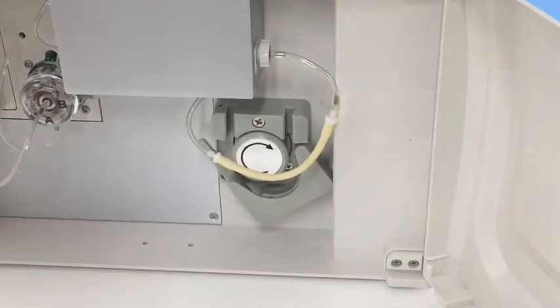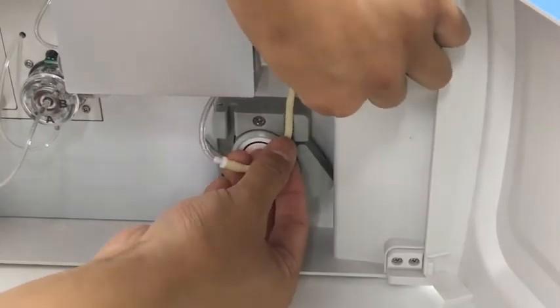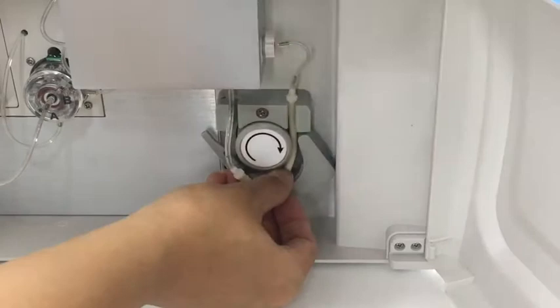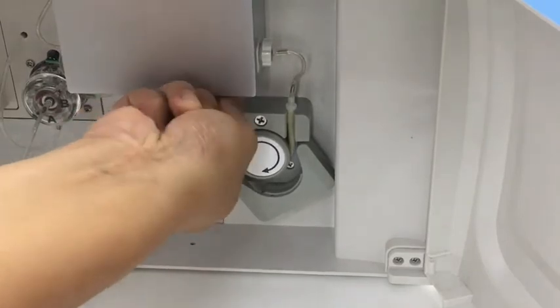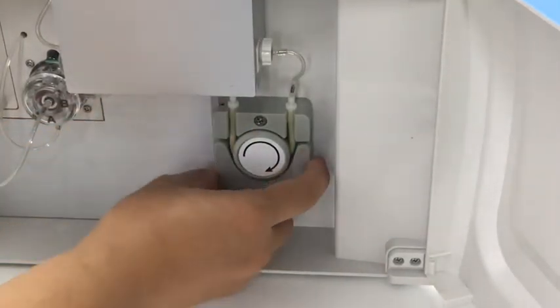Now let's install the pump tube. We hold the pump tube like this and put it in the slot. Then we pull it around the pump head, then pull it, put the other end at the slot, and lock it.